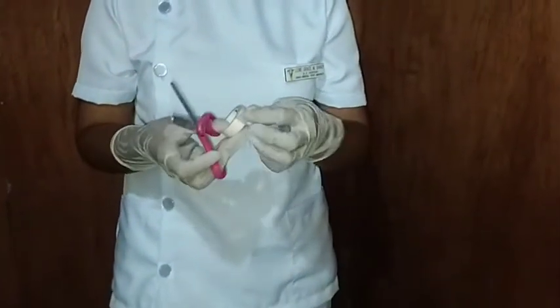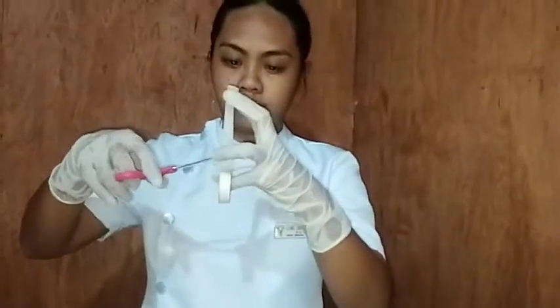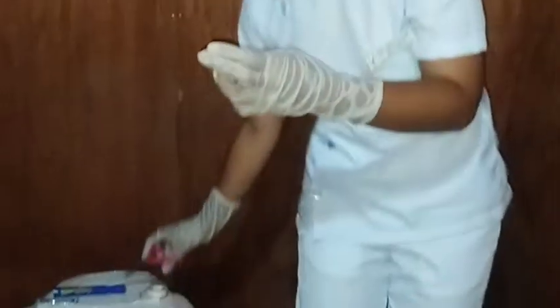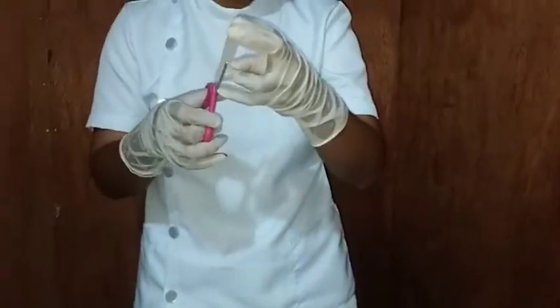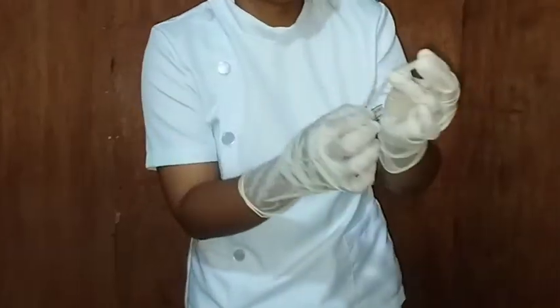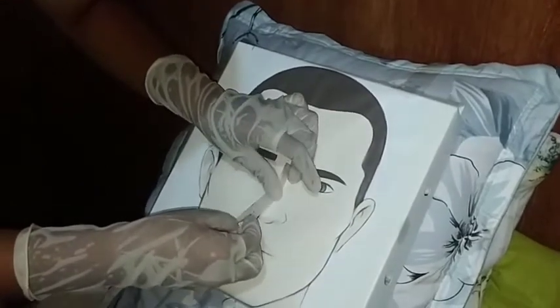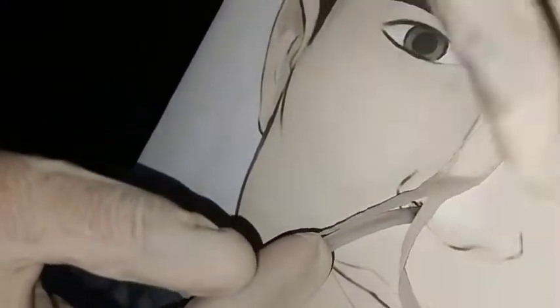Secure the tube by taping it to the bridge of the client's nose. If the client has oily skin, wipe the nose first with alcohol to defat the skin. Apply a commercial securement device. Cut 7.5 cm of tape and split it lengthwise at one end, leaving a 2.5 cm tab at the end. Place the tape over the bridge of the client's nose and bring the split ends either under and around the tubing or under the tubing and back up over the nose.